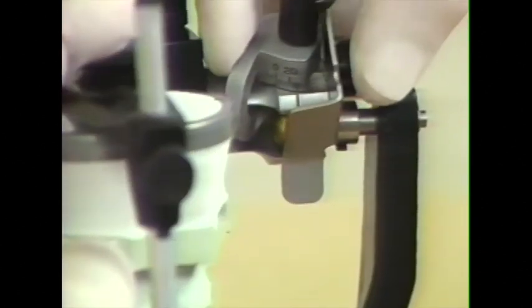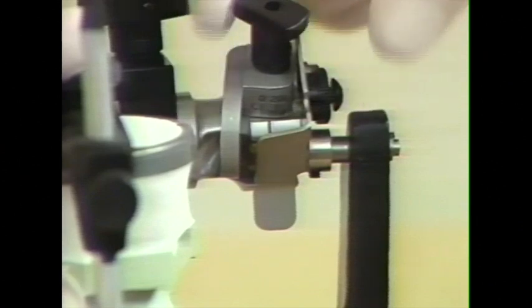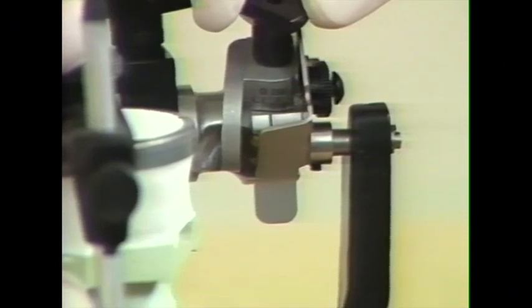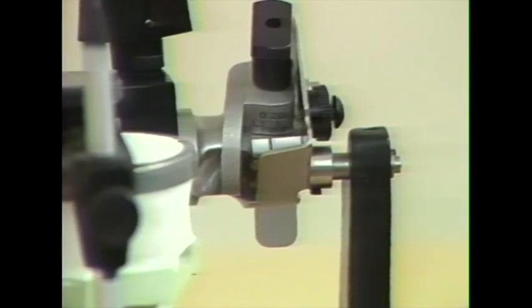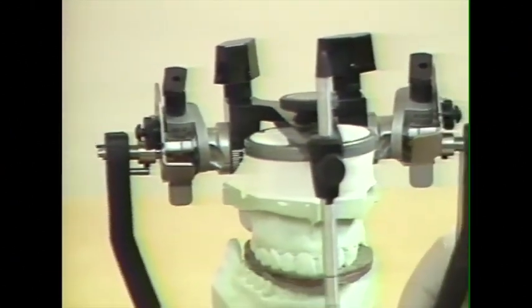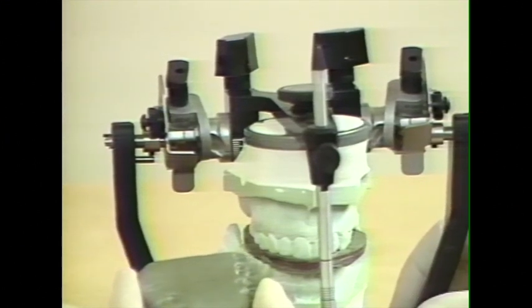And now, to set the Bennett angle, we move the Bennett guide until it contacts the condylar ball, and we've recorded a Bennett angle of between 10 and 15 degrees, about 12 degrees, and we lock that into position. To set the opposite side, we use the left lateral record and use the same procedure.